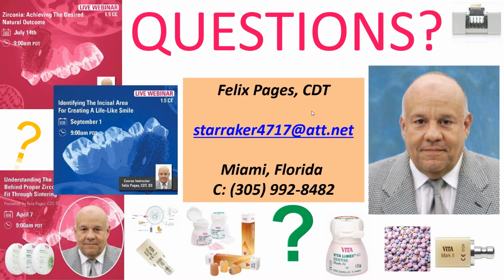I use the old VITA accent glaze Fumo 3, which is dark brown, and it's real gritty. And what you do is, if you use a decent anatomy in any of your milling libraries, I take water and I load up a little brush and I just scrub the whole crown. It looks awful. And then I take a dry brush and I wipe everything out. So the only place that it stays is exactly how a natural molar gets stained in the mouth. So I put it on, wipe it off, so if I have little pits and little things like that, I can control it.